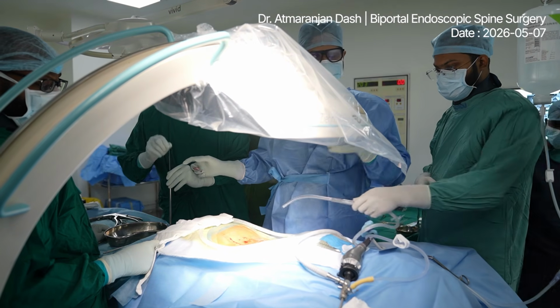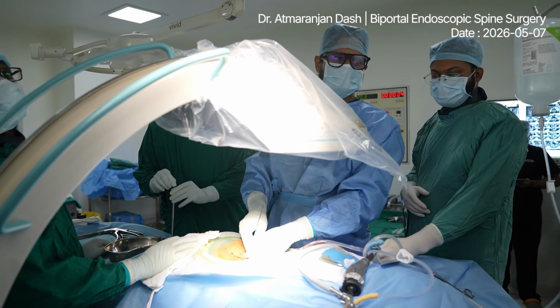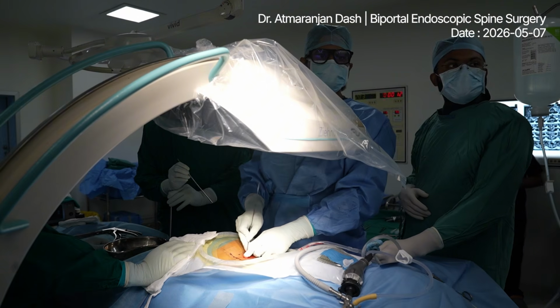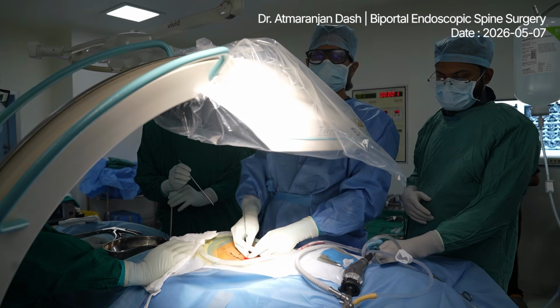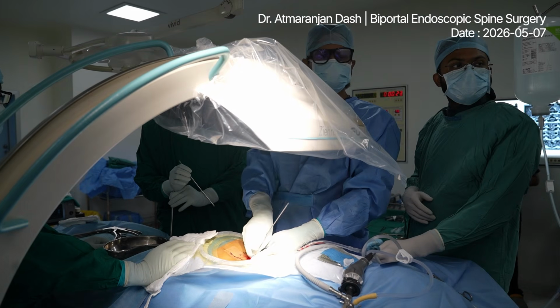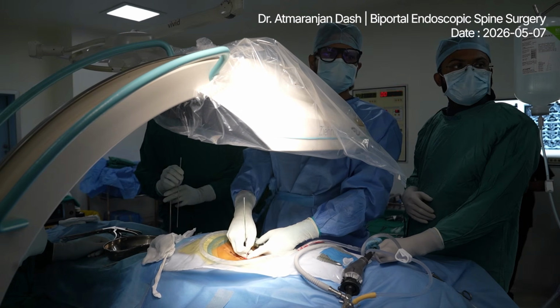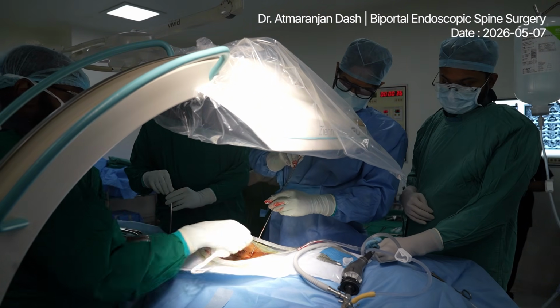First we took an incision where you put the pedicle screws. The same way, you just put it there, palpate the TP, shoot. So now I am palpating the TP, take a shoot. Once you palpate the TP, half of the work is done. Now we are palpating the TP, and now we will do the dilatation.